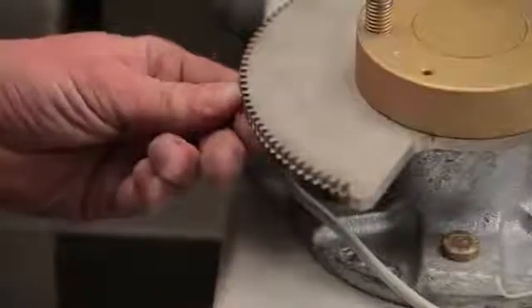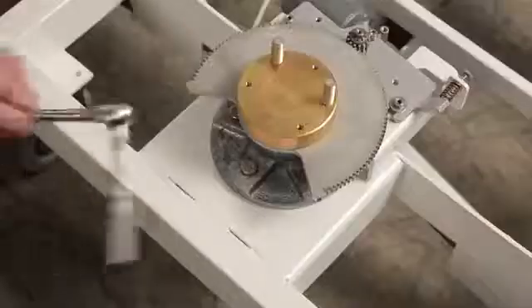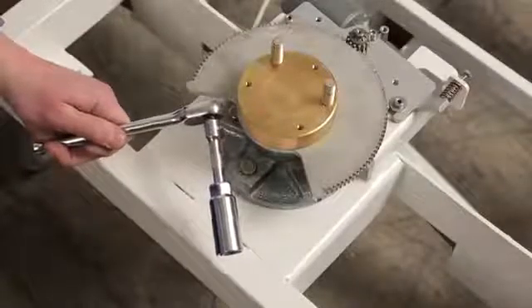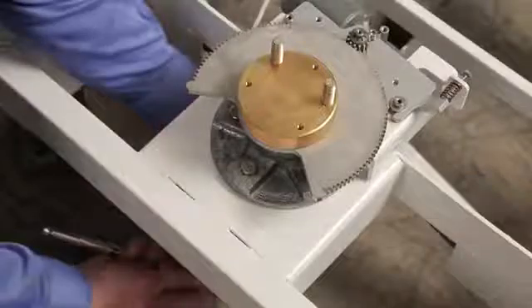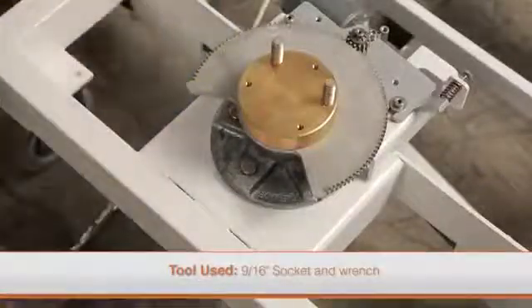If the large gear is damaged, then the hub assembly needs to be replaced. For the PAL and PAL2, the nuts that secure the hub assembly to the frame must be accessed from underneath the frame using a deep well socket. Loosen the nuts and remove the hub assembly.